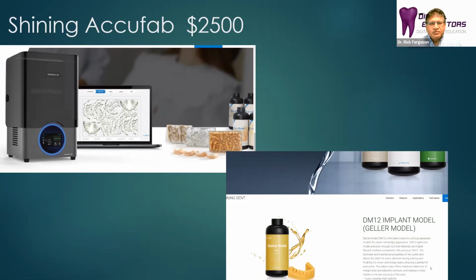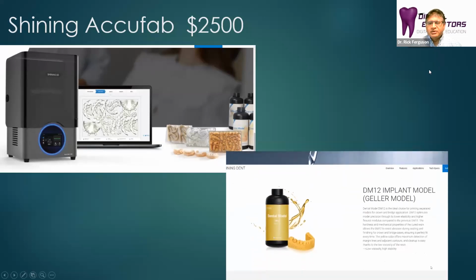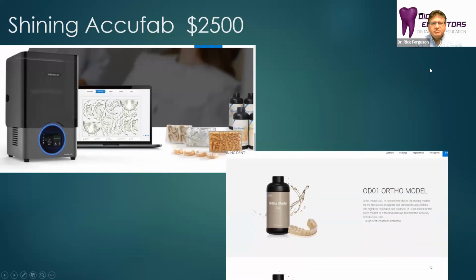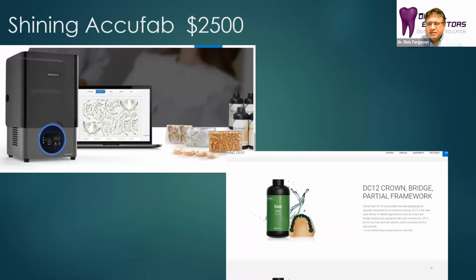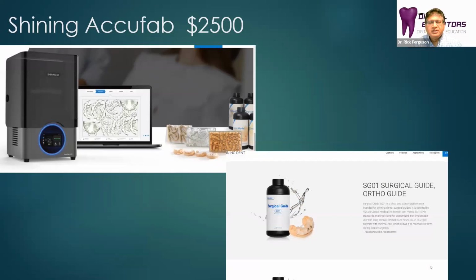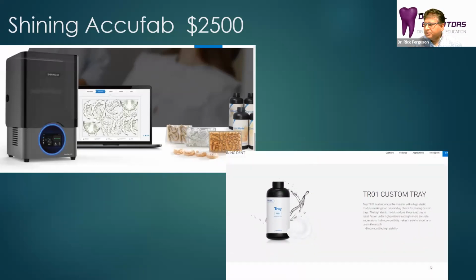And another printer that we've just acquired that is actually a pretty good printer is this Shining Accufab printer, which is sort of a medium range price point. Again, it is an LCD type printer, but Shining, of course, has been in the dental field for a while. And I know Blue Sky at least used to carry some of their desktop scanners.